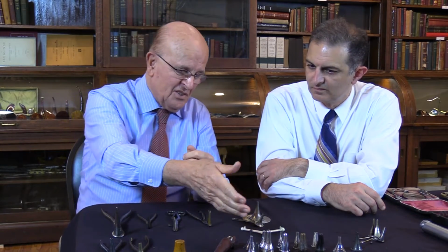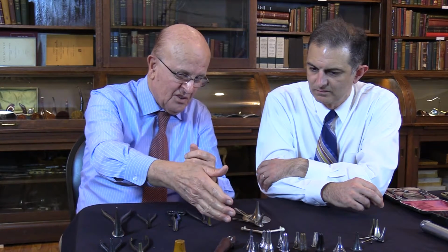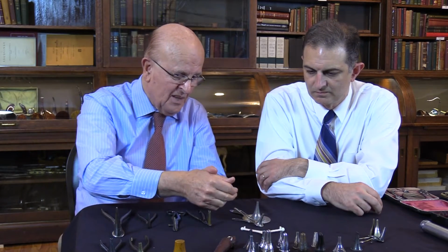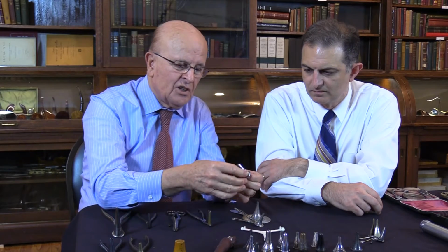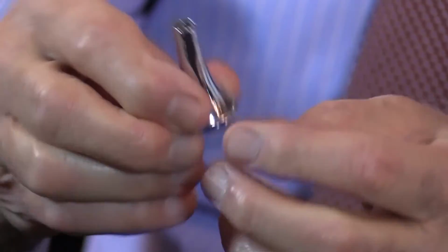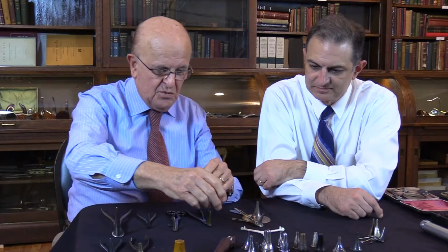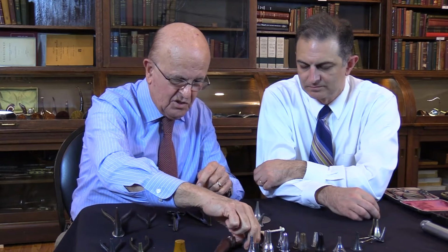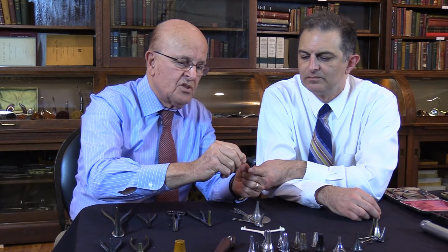And so we have here a group of ear specula invented by different fathers of our specialty, so to speak. For instance, this here is the Hartmann ear speculum. They used to come in sets, different sizes. As you can see, it narrows towards the base, and then you have the base opened here. The difference between Hartmann and the Politzers is that they are basically the same, but Politzer doesn't have a rim.